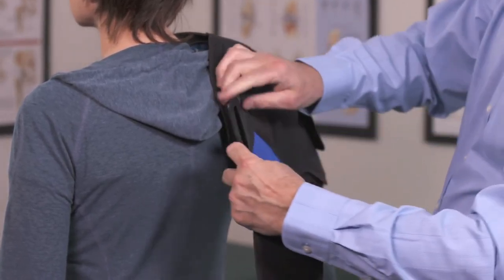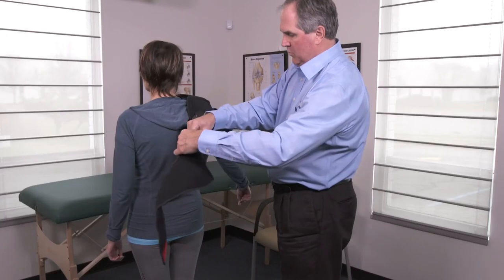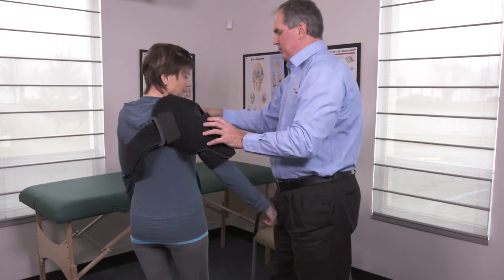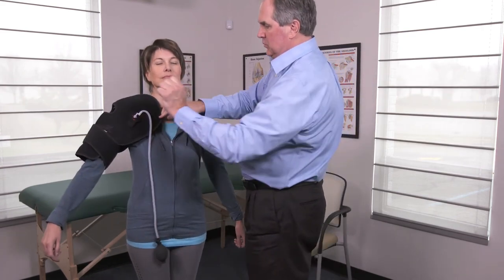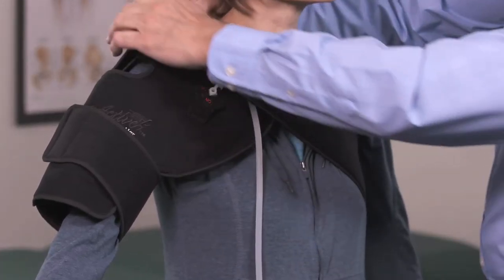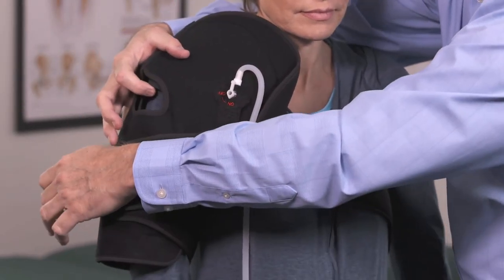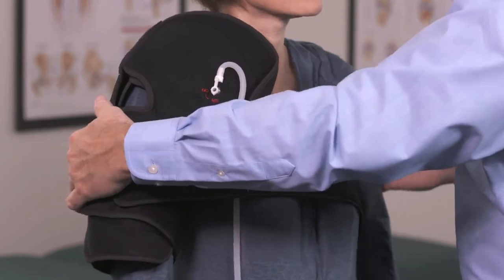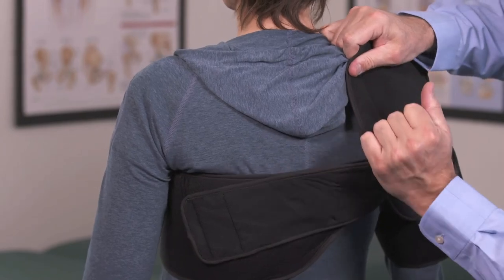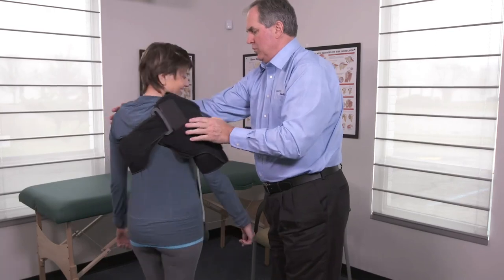The blue hook material is attached to the body strap in a general position to start. Bring the body strap around the back, under the arm opposite the injured shoulder, and across the chest. Attach the strap using the red hook end. The first fitting shows the body strap high on the shoulder; the second fitting shows the body strap being placed in a lower position. The choice of where to place the body strap may be provided by the health care professional. The floating D-ring allows you to adjust the body strap for the correct position for height, shape, and angulation.